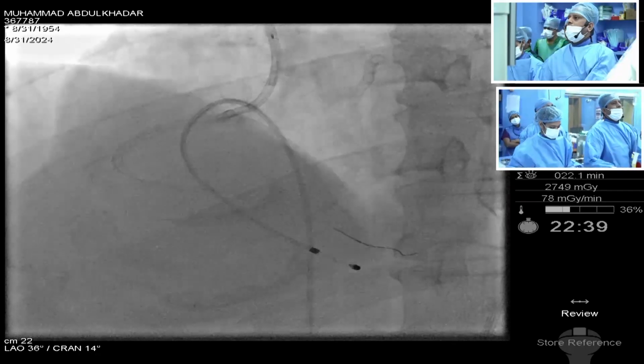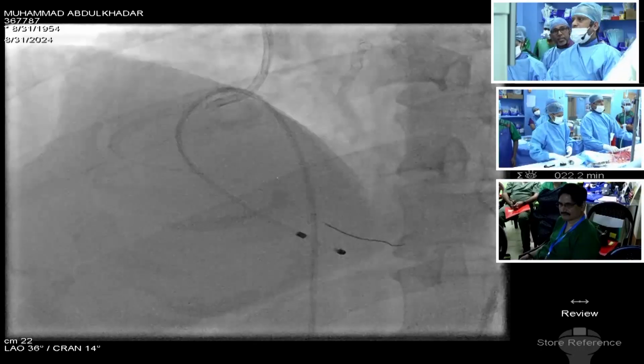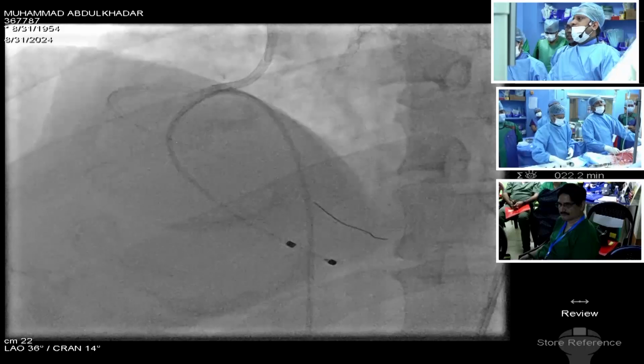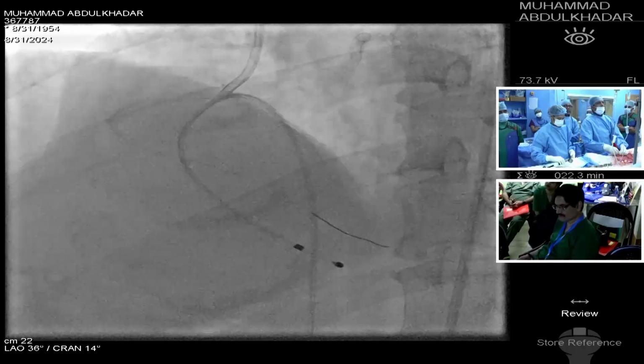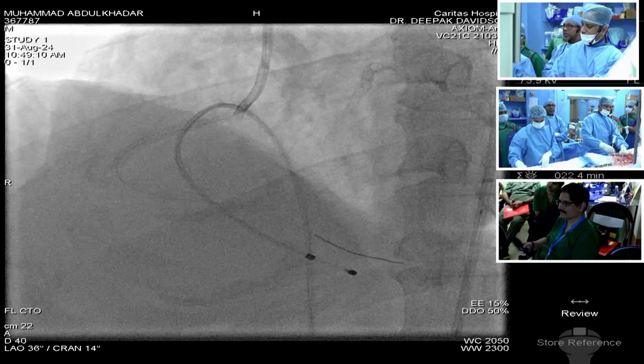And did the stent go in without difficulty, or with the guide extension we had to push it with the guide? It always happens in these sort of difficult lesions. However much you prepare the lesion, you would mostly need a guide extension catheter to get the stents across.